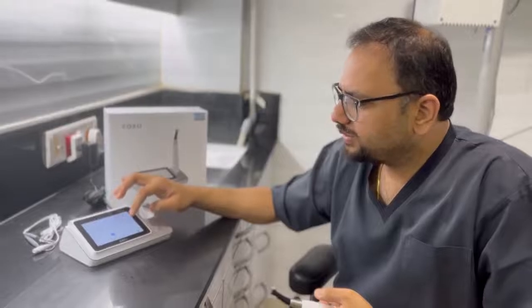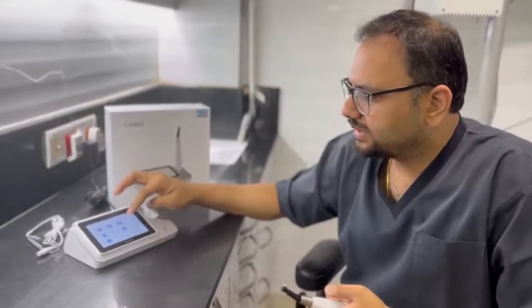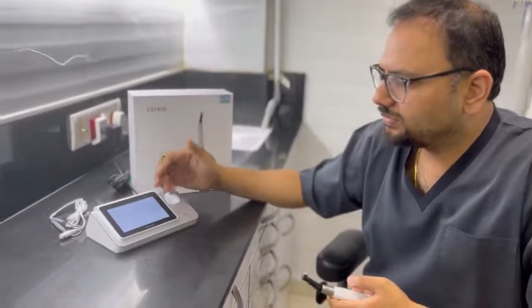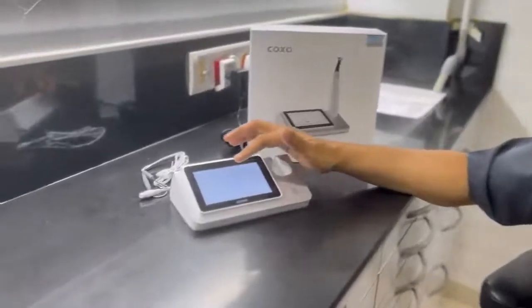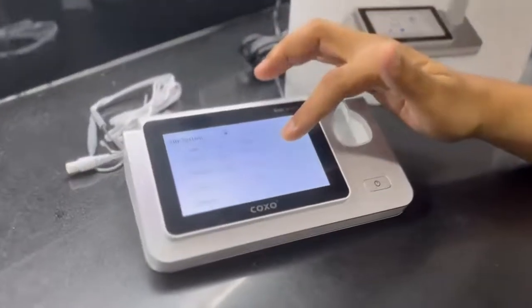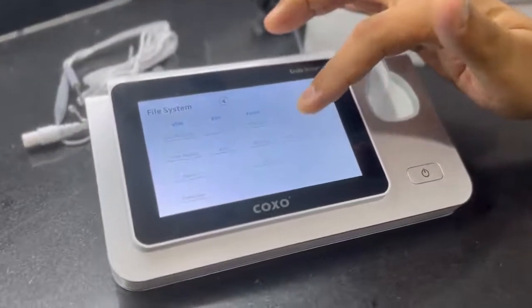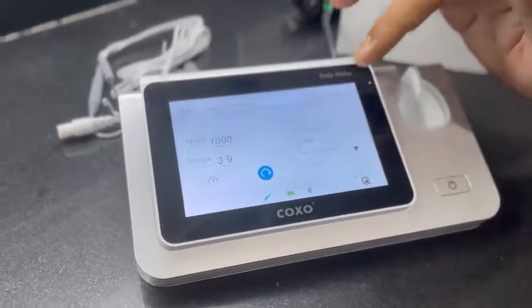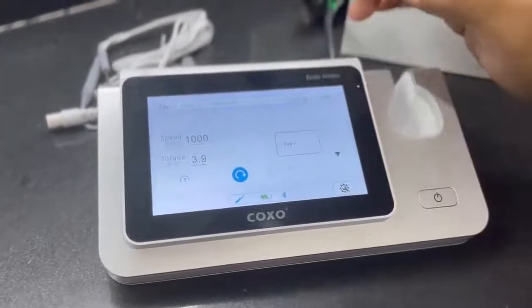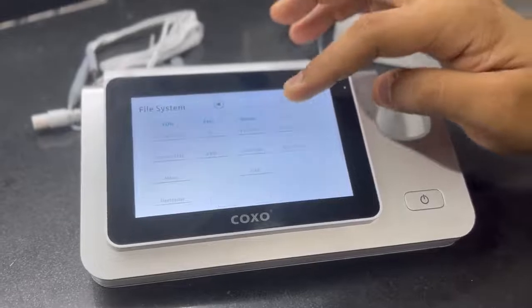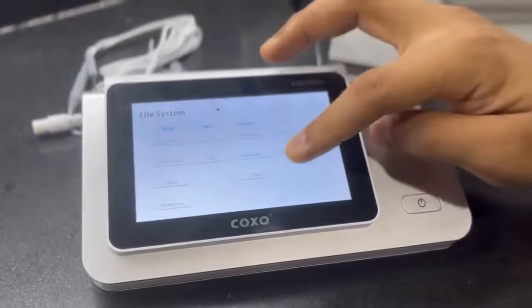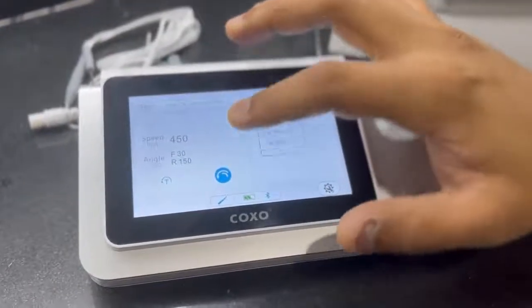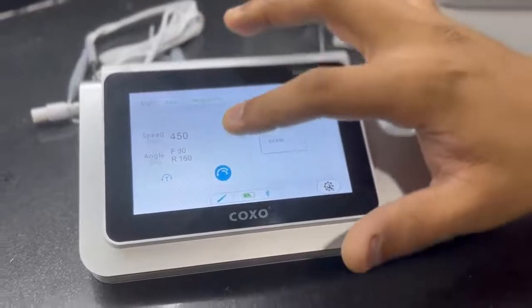The other unique feature of this is that you can also customize your settings. So if you don't find your particular file system over here, you can customize the settings as per rotary or reciprocation files. For rotary files, you can go to a maximum speed of 1000, and for reciprocation files, you can adjust the individual angles as well as the speed.